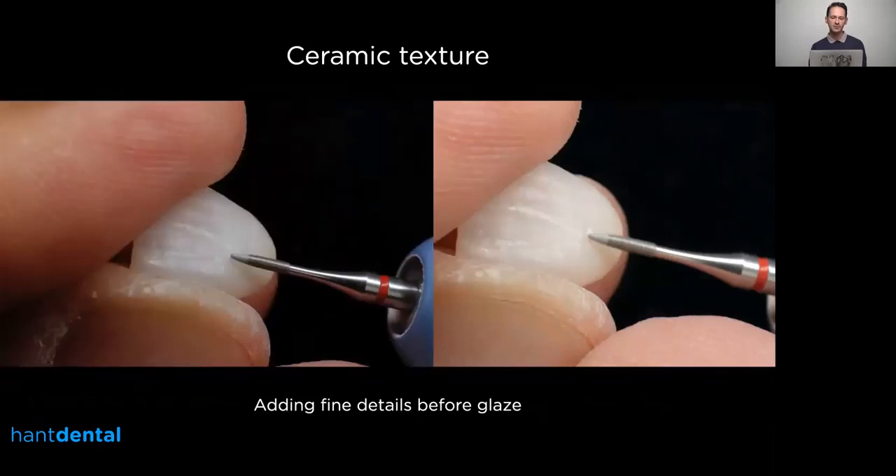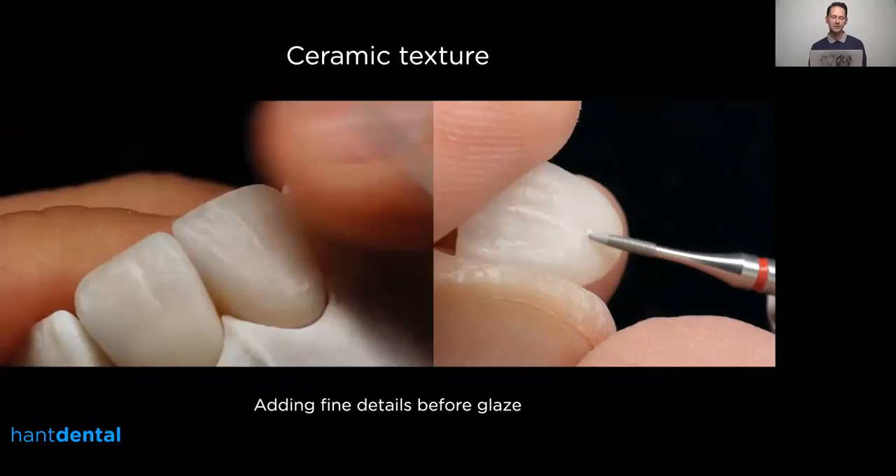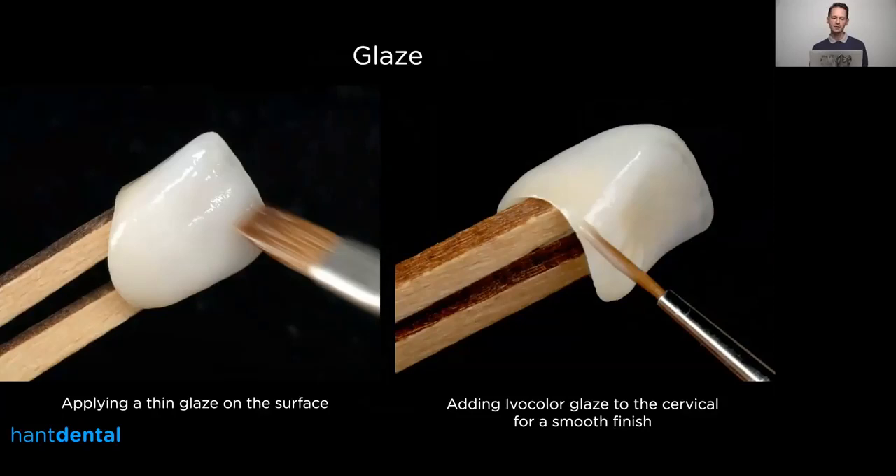After the polishing, I sometimes use a fine diamond to create extra fine details, usually under a microscope at about 10 times magnification, where you can see really nicely the fine details you create. Then I do the glaze — I use a glaze powder mixed with stain liquid. It depends on the case and the shine and luster you want to achieve. Sometimes I'm not using any kind of glaze, but if you use glaze powder or paste the end result is much shinier and smoother on the surface. Where it's not perfectly smooth I apply some Ivoclar glaze to have a nice surface for the tissue, because tissue prefers a nicely clean and highly polished cervical area.